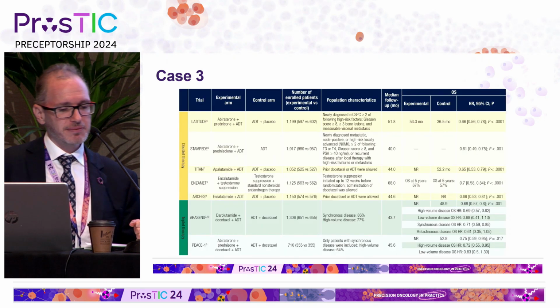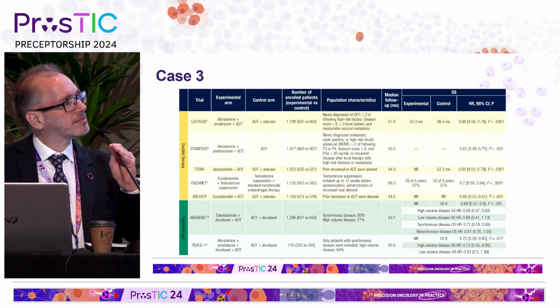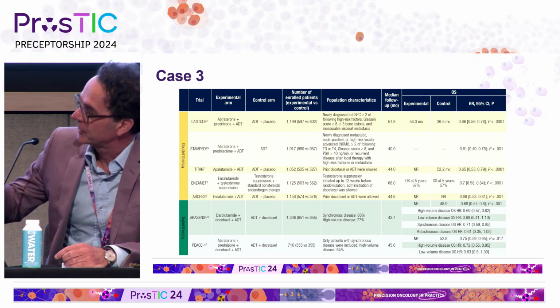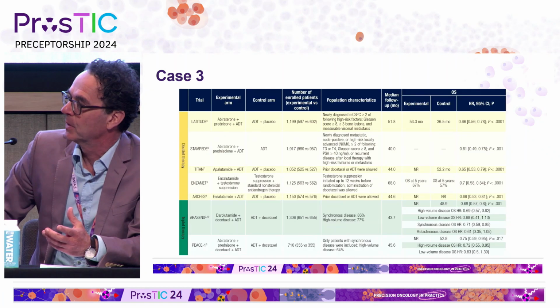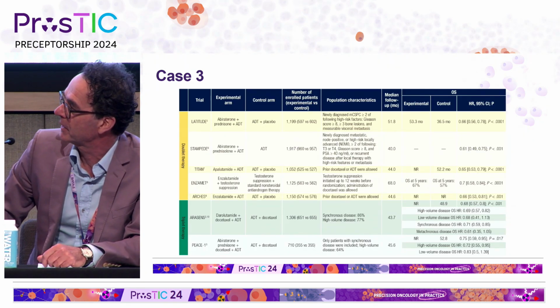I think, Michael, that is controversial. What's really interesting is when you re-PET these guys at, say, 3 to 6 months after very heavy systemic treatment, there is still uptake in the primary. So you can see why there might be a benefit to some local radiation by taking out the evil clonogens that are lurking in the mothership.